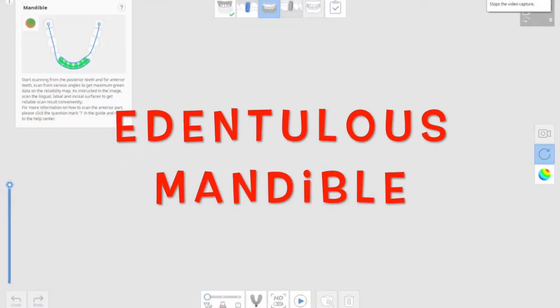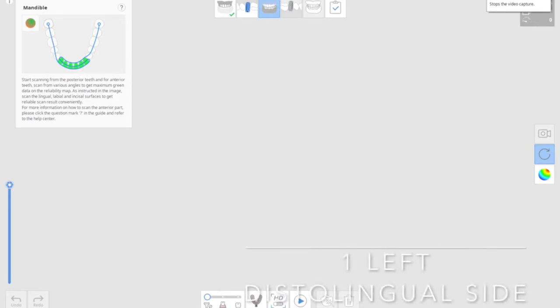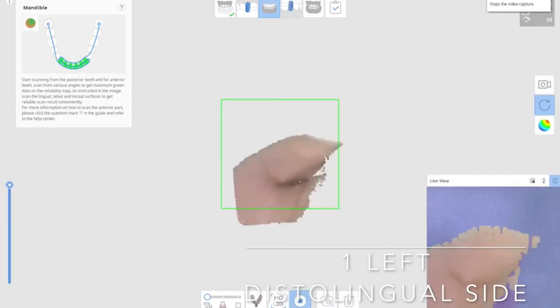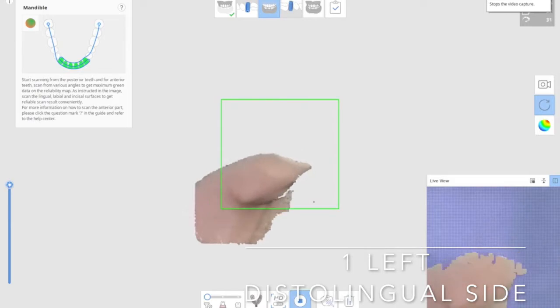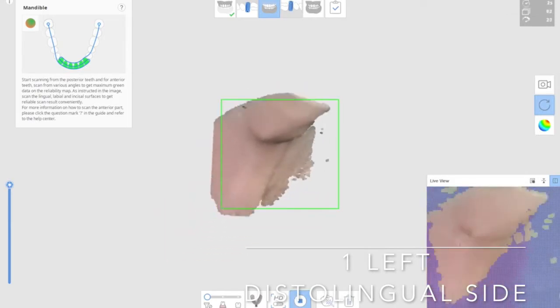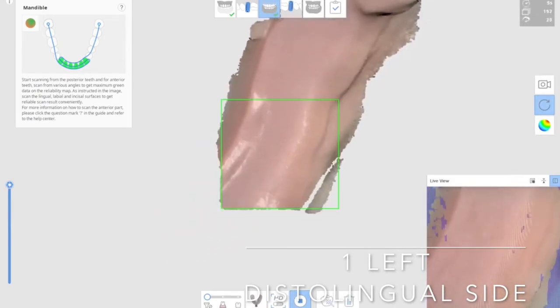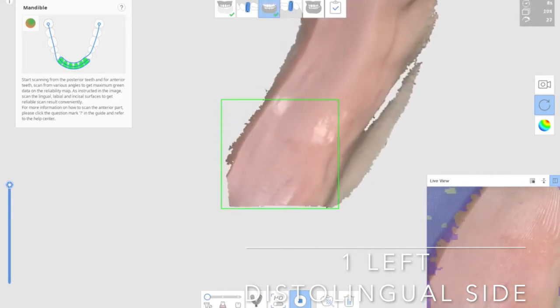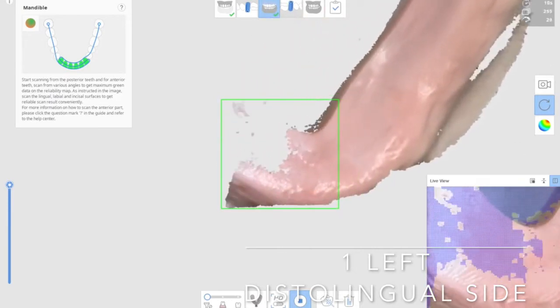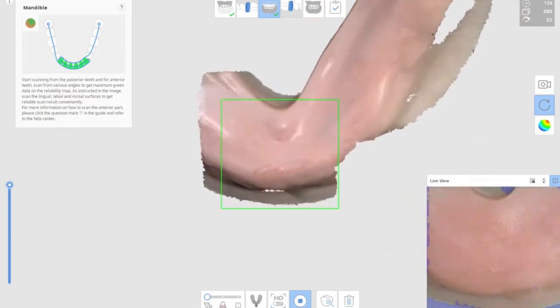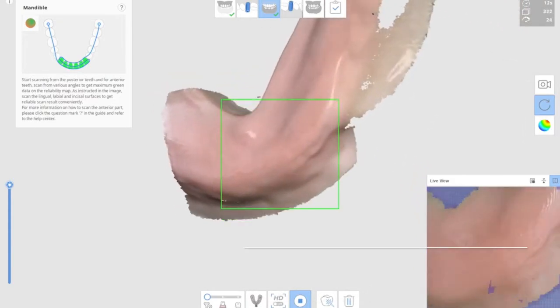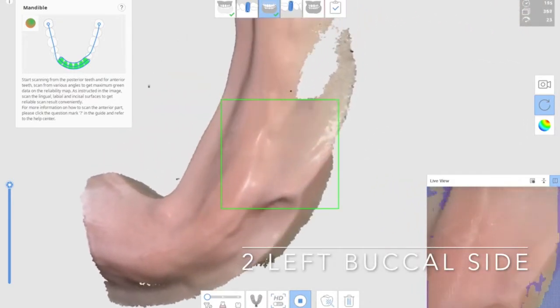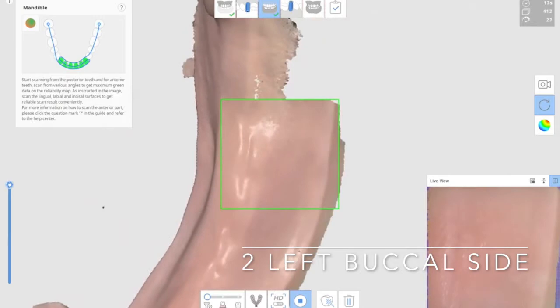We're going to start from the left distal lingual side first from the retromolar pad, scanning well on the lingual surface including the lingual vestibule. And then the second part will be the left side, the buccal side, left buccal vestibule.